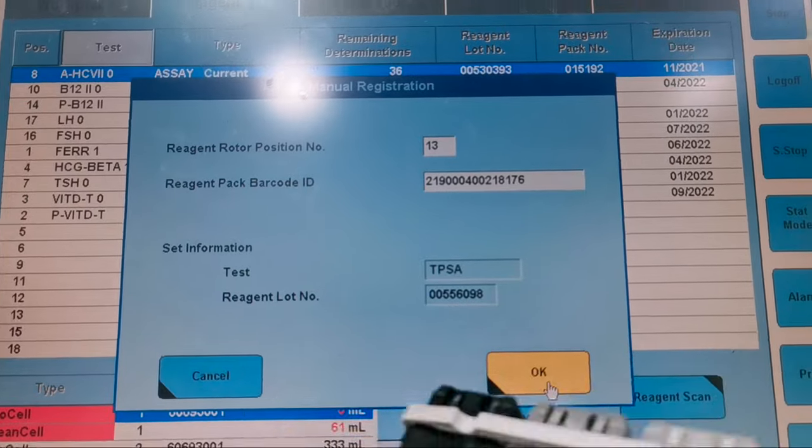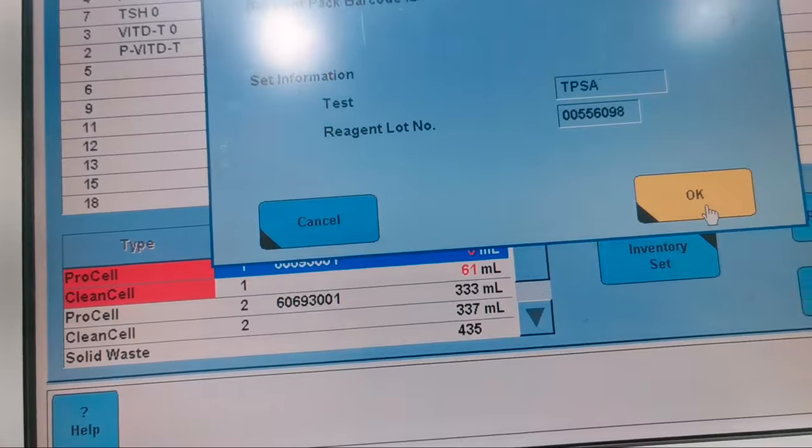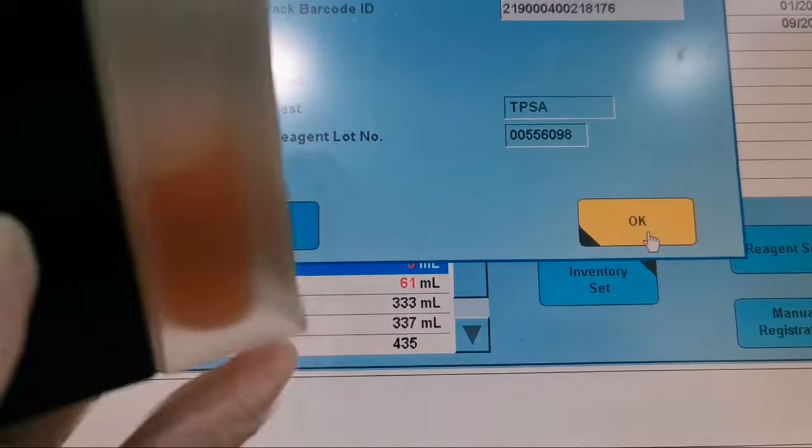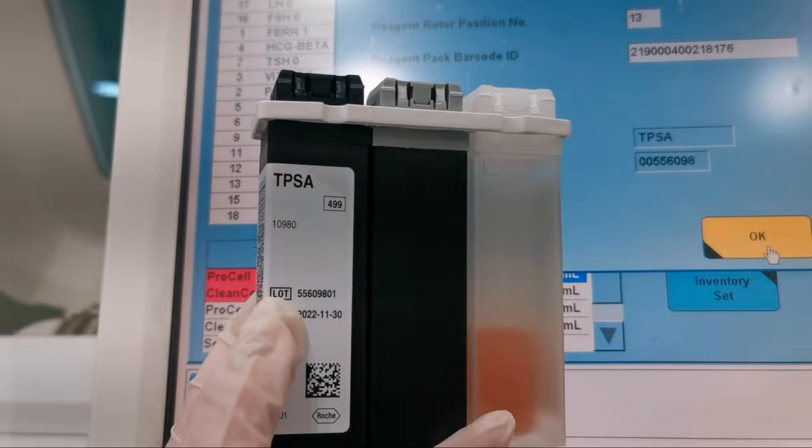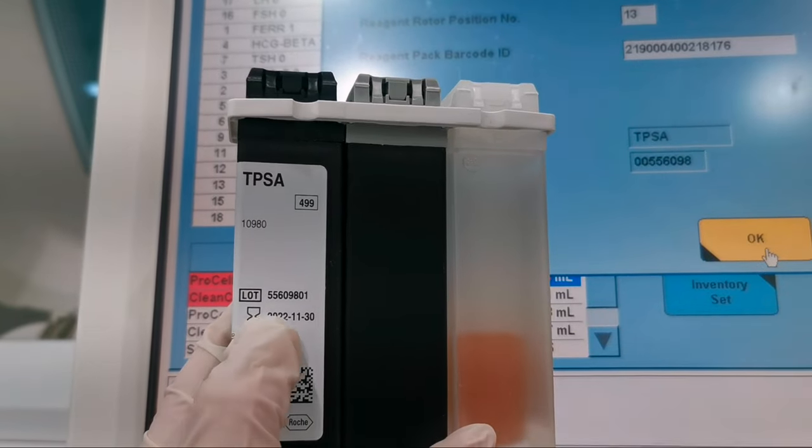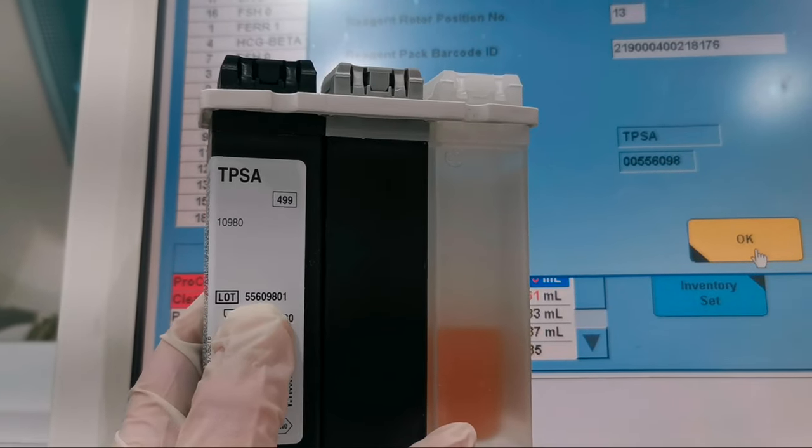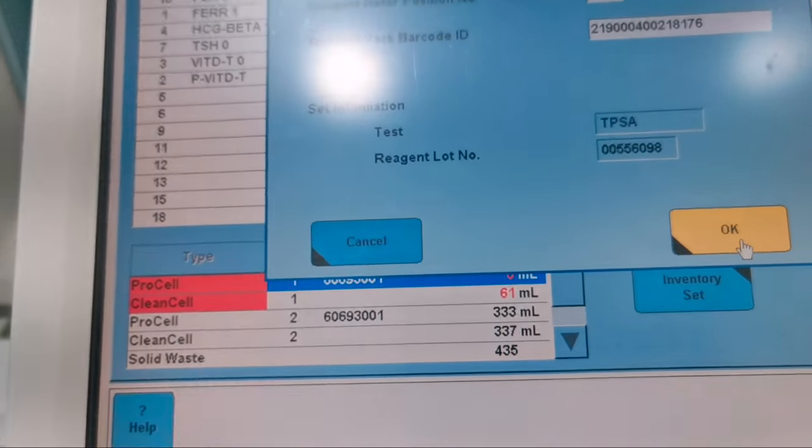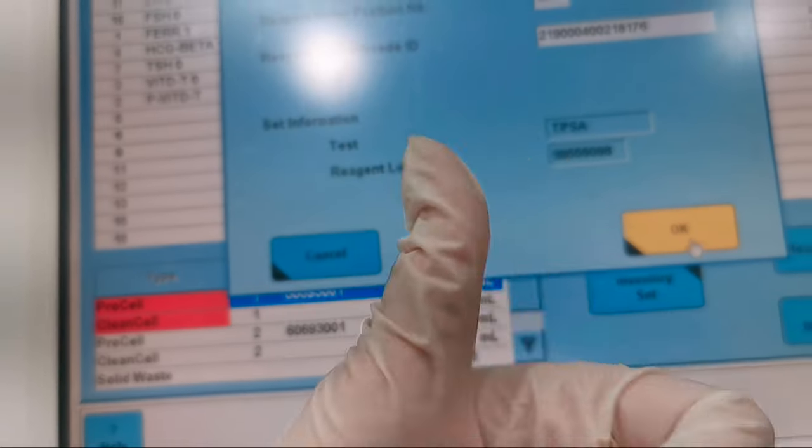Now the reagent pack information will appear. You will see the reagent and the lot number. Press OK.